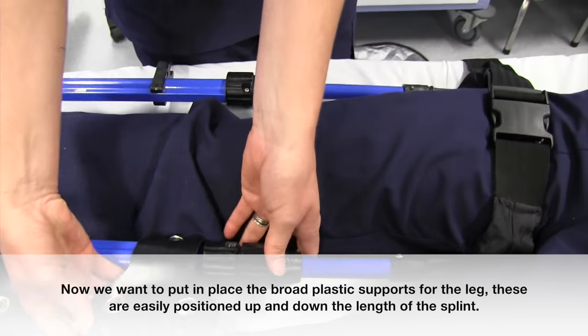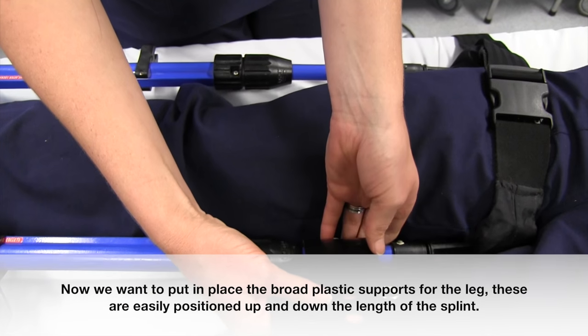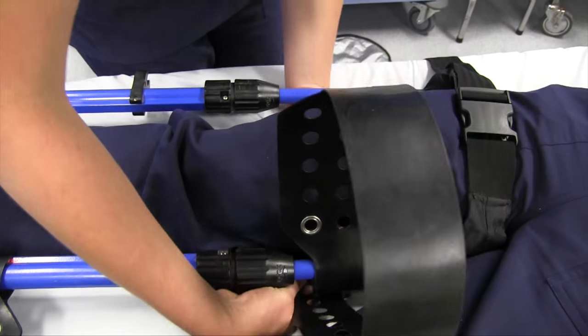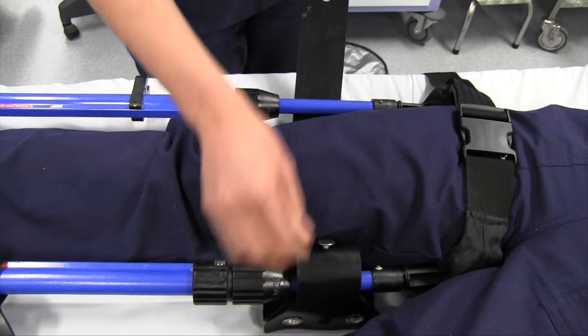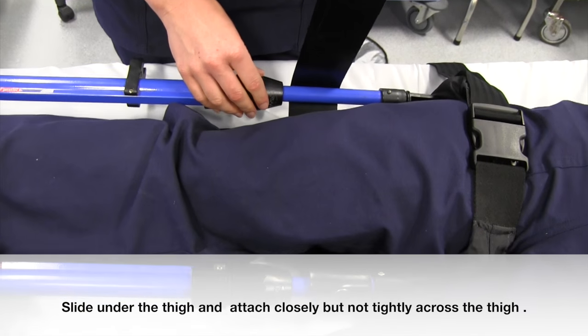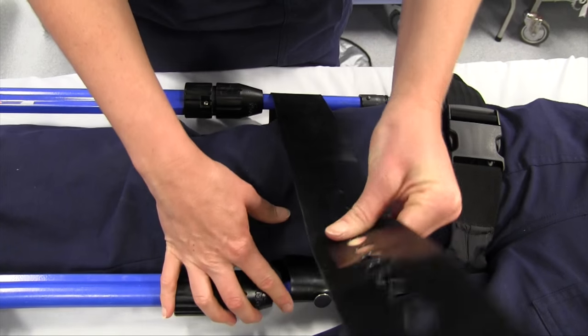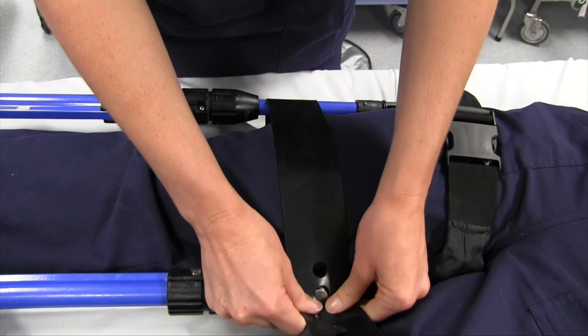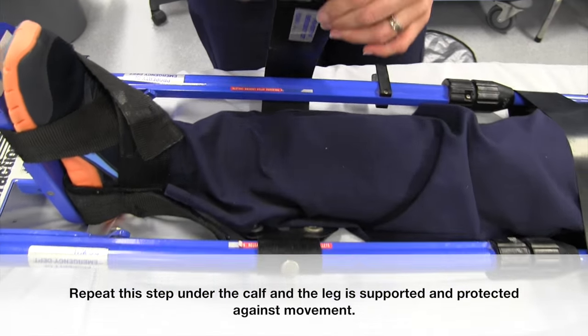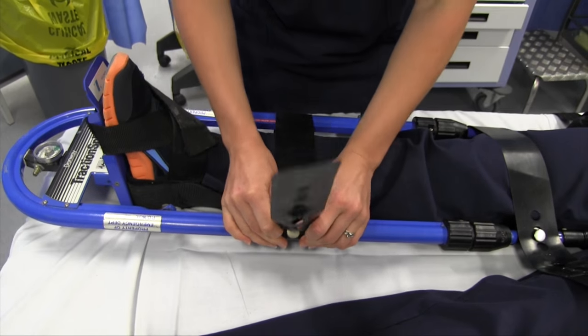Now we want to put in place the broad plastic supports for the leg. These are positioned up and down the length of the splint. Slide under the thigh and attach closely, but not tightly across the thigh. Repeat this step under the calf and the leg is supported and protected against movement.